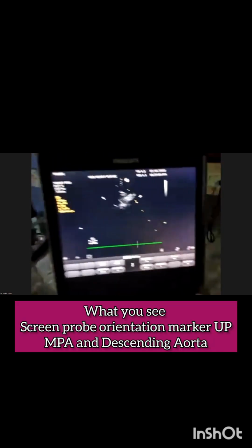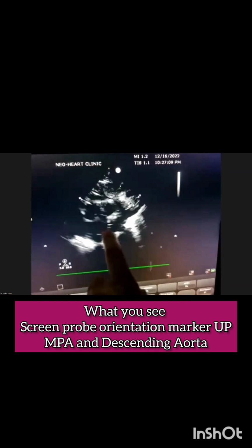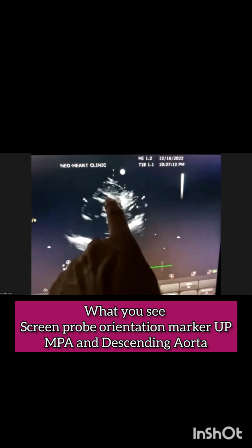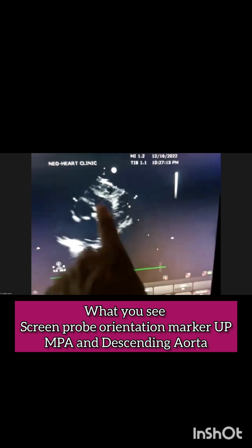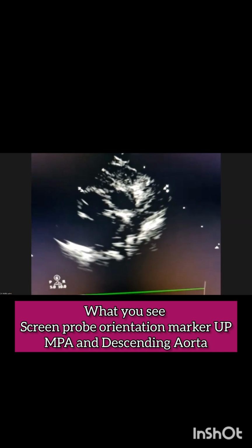the probe a bit on the left side, and on the screen you will see the probe orientation marker is up there, and what you will be seeing is this pulmonary artery, MPA, and then this descending aorta. The other vessel which is going from down, you can see this black one, is the descending aorta.